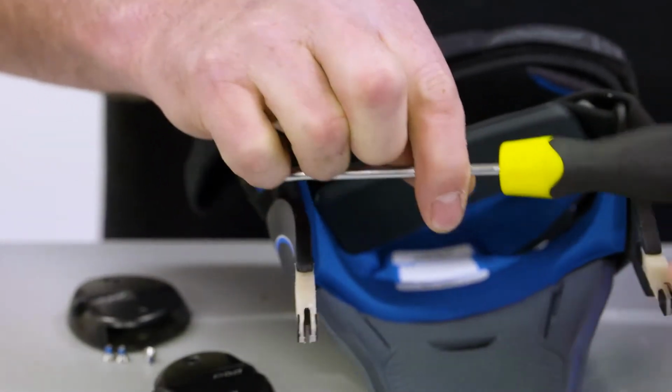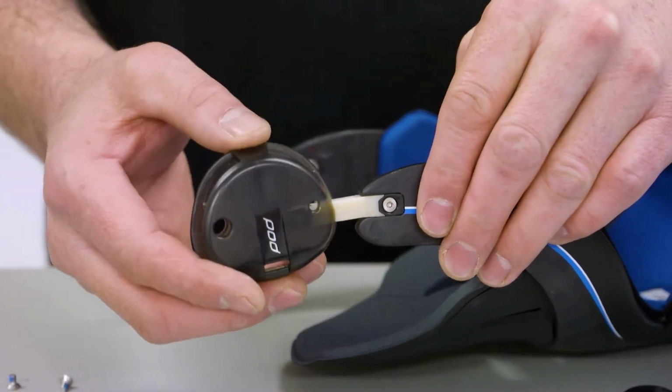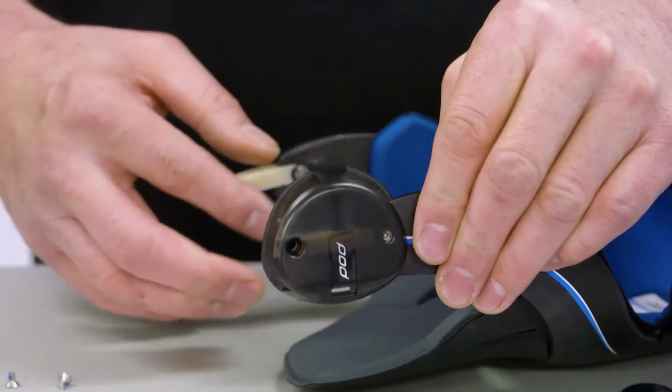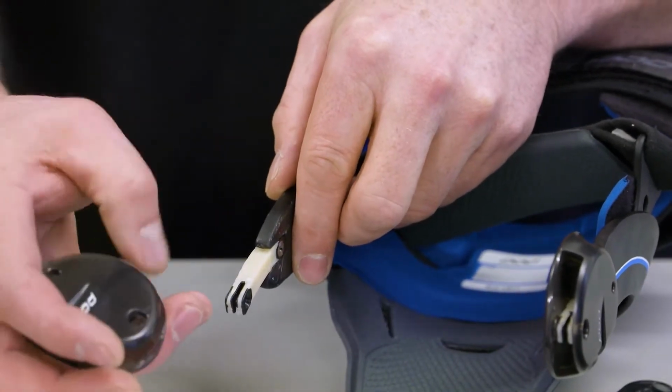Now that you've attached the ligaments to the upper frame, take a hinge housing and slide them straight over the ligament onto the upper frame. They will only fit one way with the pod logos at the front of the brace.